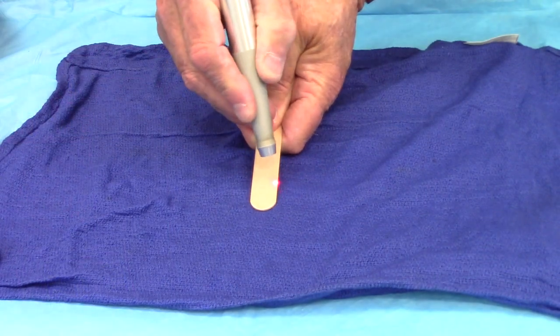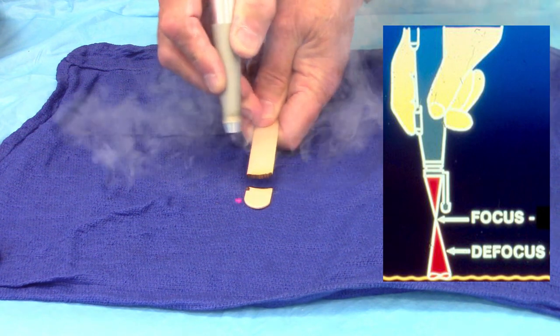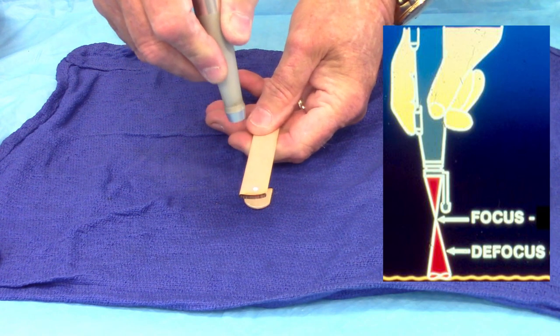Here we have the laser sharply in focus. Now if we back it up a little bit, you'll see the spot size get larger.